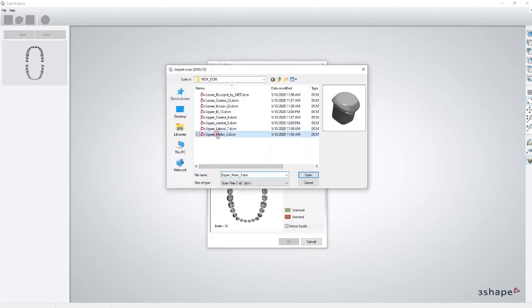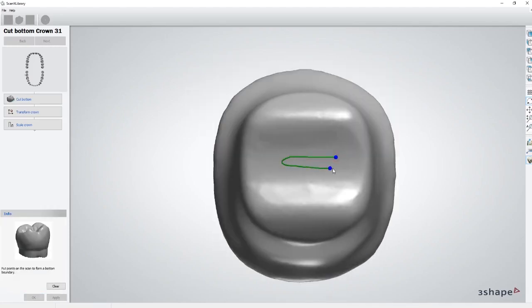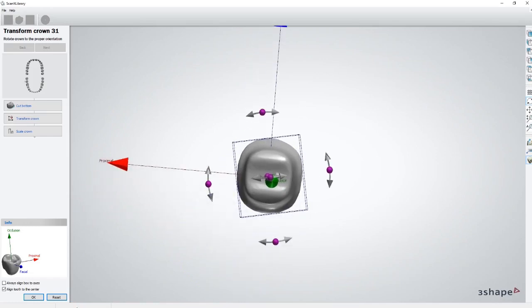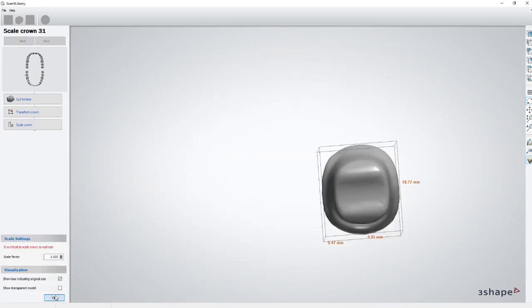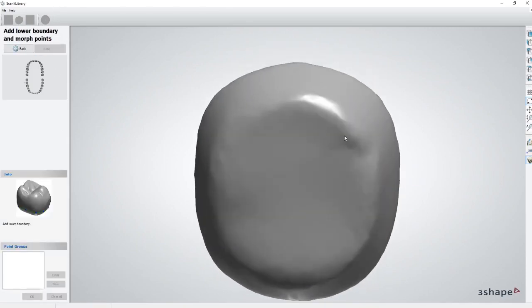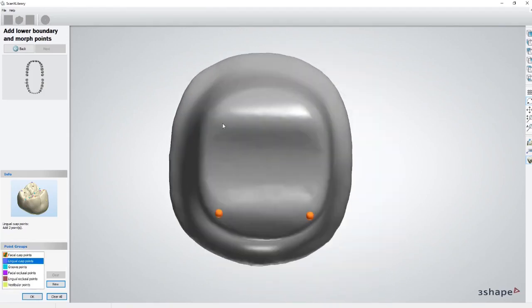Like I said before, I'm using the lower molar that I used from the upper molar as well. So I have to use the boundaries here. And then I can adjust the tooth in the coordinate system, and that's pretty easy. Do it to the occlusal, facial, and proximal coordinates. You can adjust it here. And then I have to add some facial points. First, I'm going to make the lower boundary, and then I have to align the facial, the lingual, and the groove points. As well as, when I turn it around, the facial occlusal, the lingual occlusal, and the vestibular point.